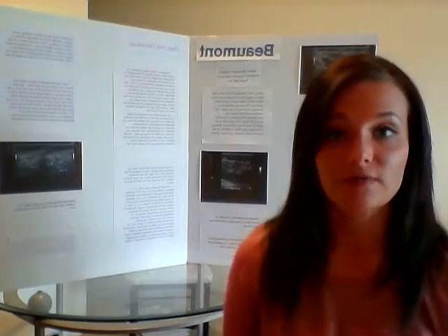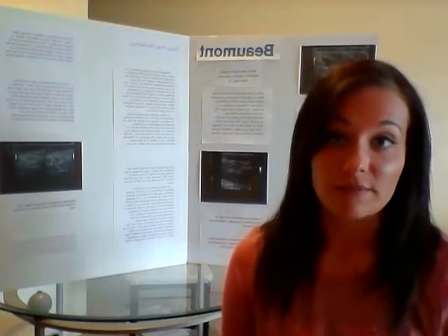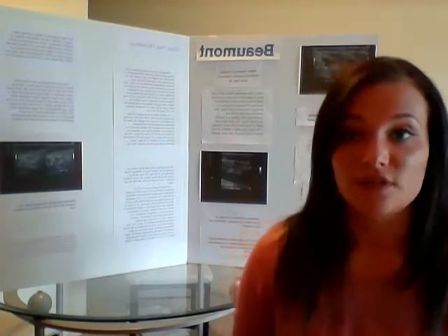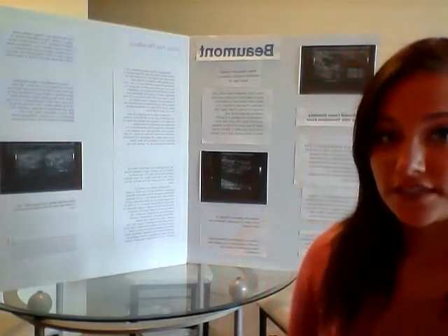I thought it was very cool because it wasn't just another boring DVT case, but you could actually see the thrombus moving within the vessel. So this is how I presented my board back here behind me. It's kind of hard to see.